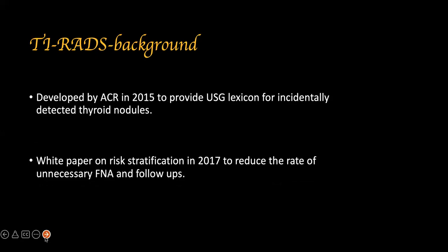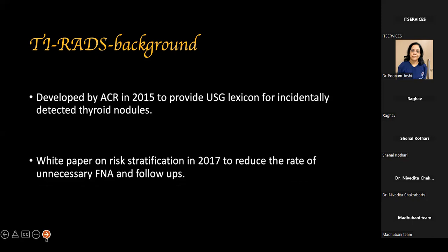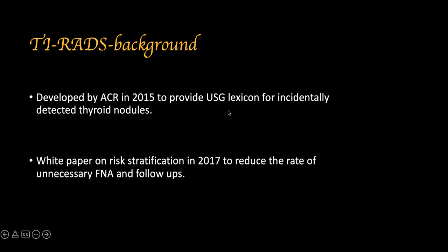So let's get started. TIRADS was developed by ACR, that's American College of Radiology, in 2015 to provide ultrasound lexicon for incidentally detected thyroid nodules. Then there was a white paper on risk stratification in 2017 to reduce the rate of unnecessary FNACs and follow-ups.